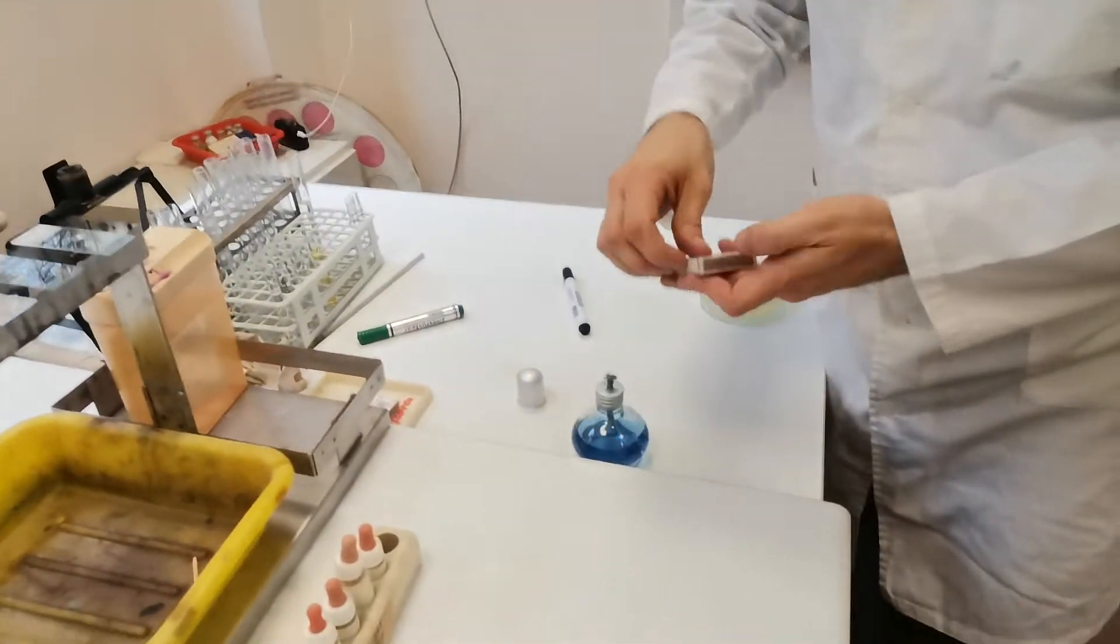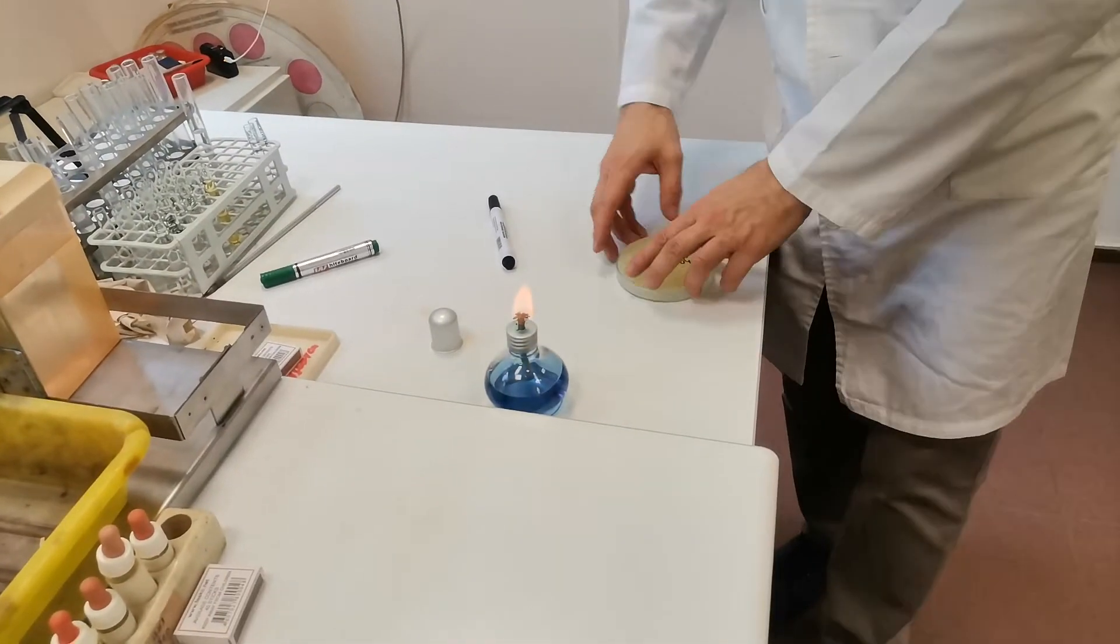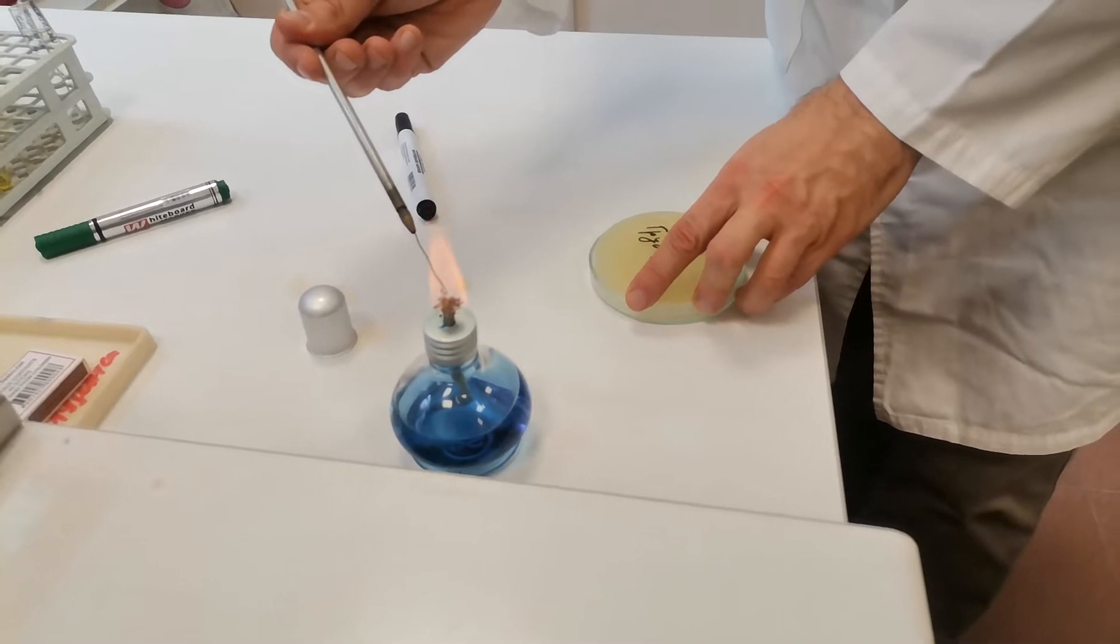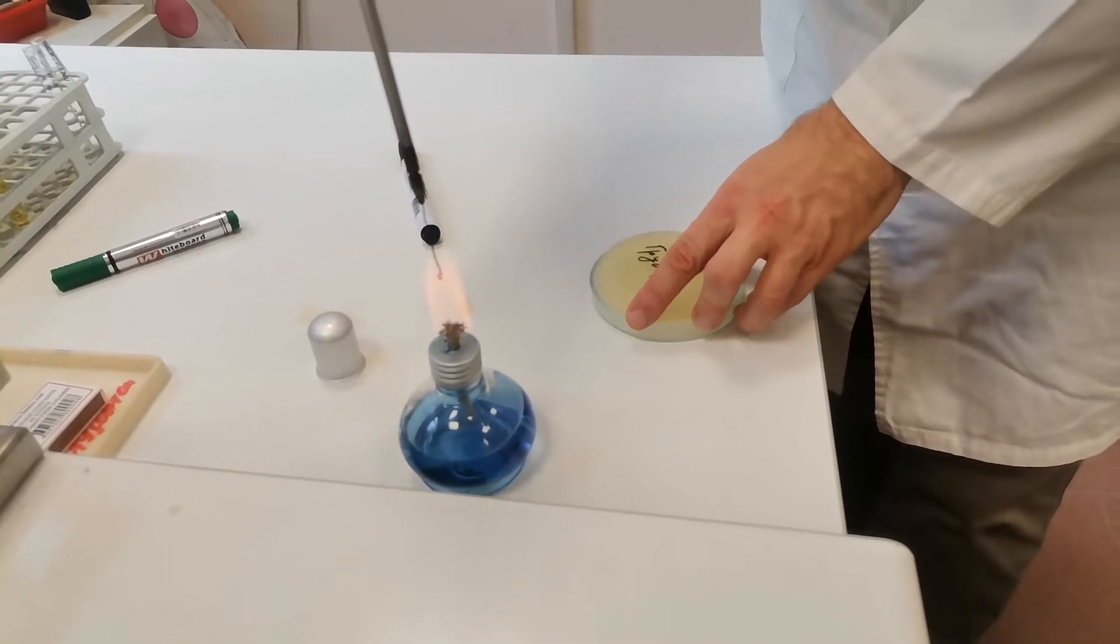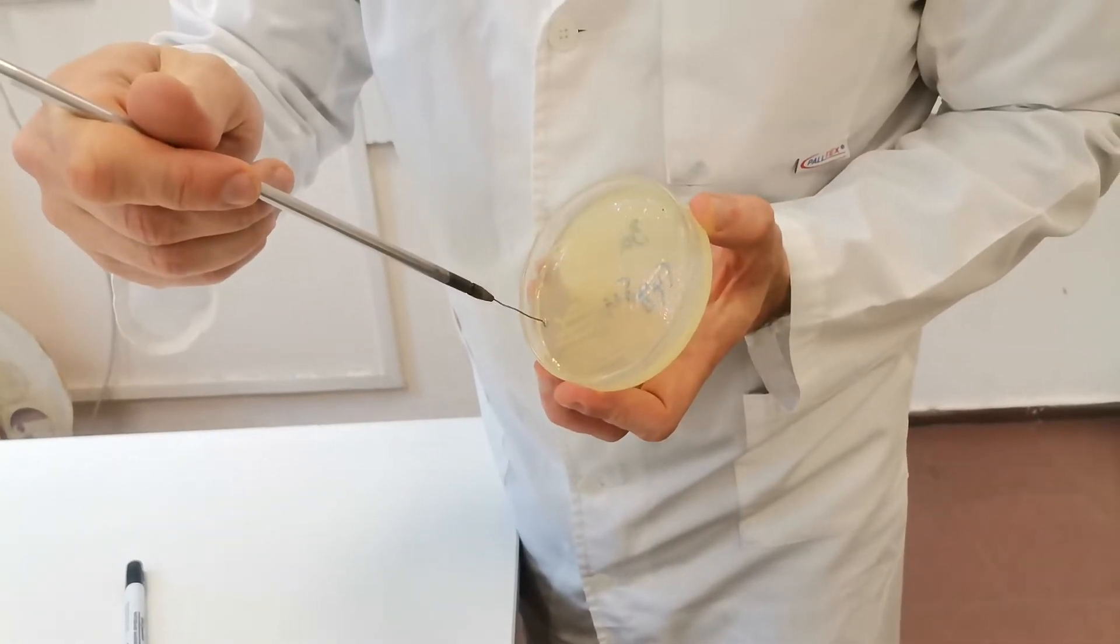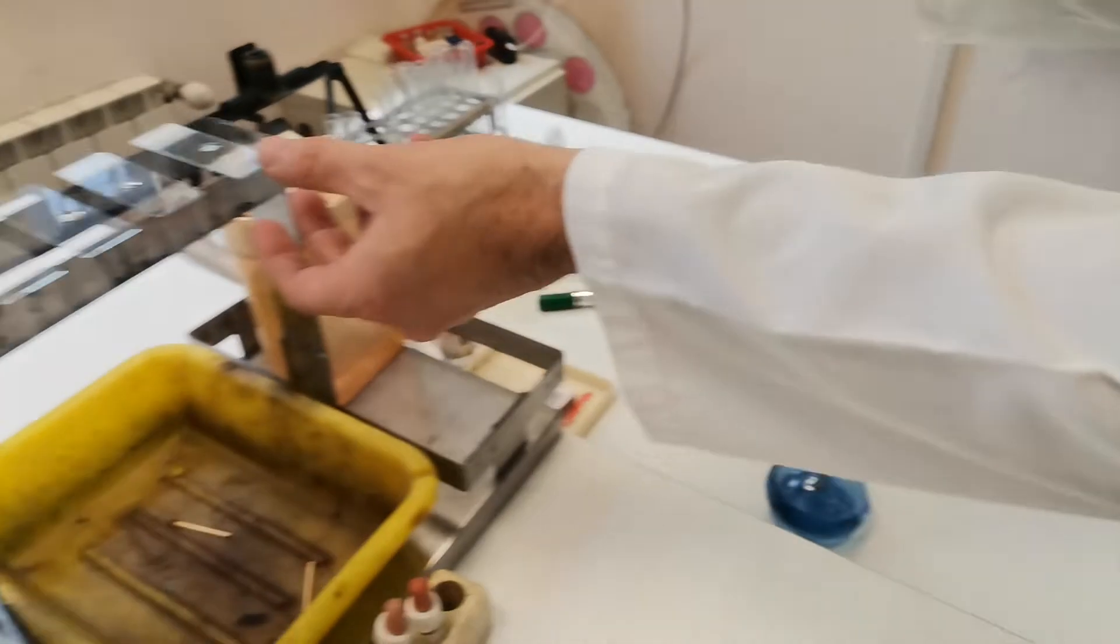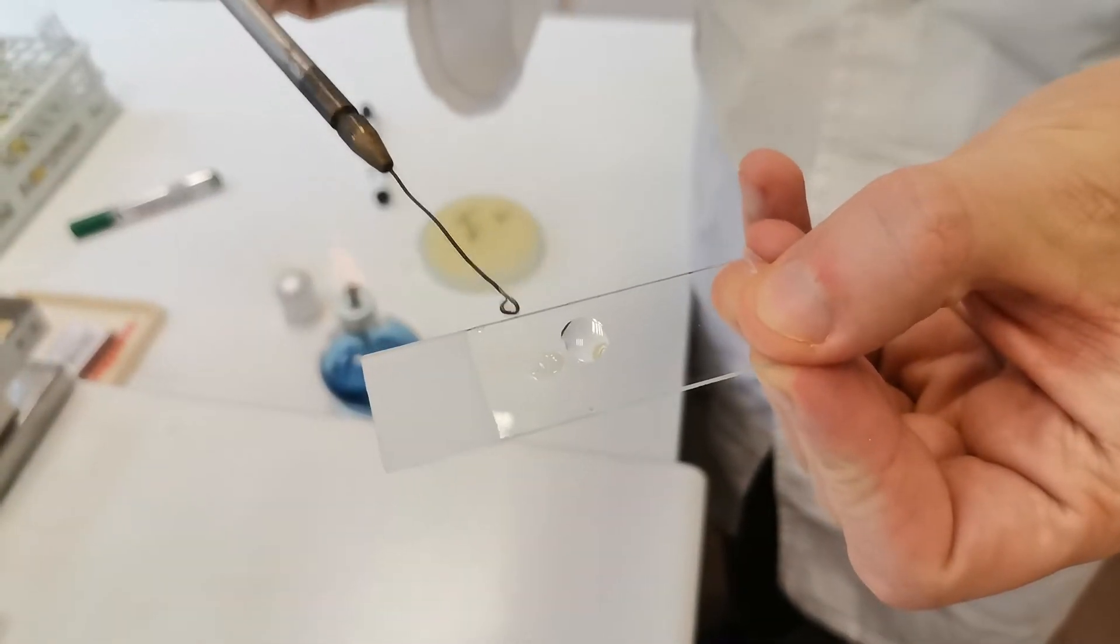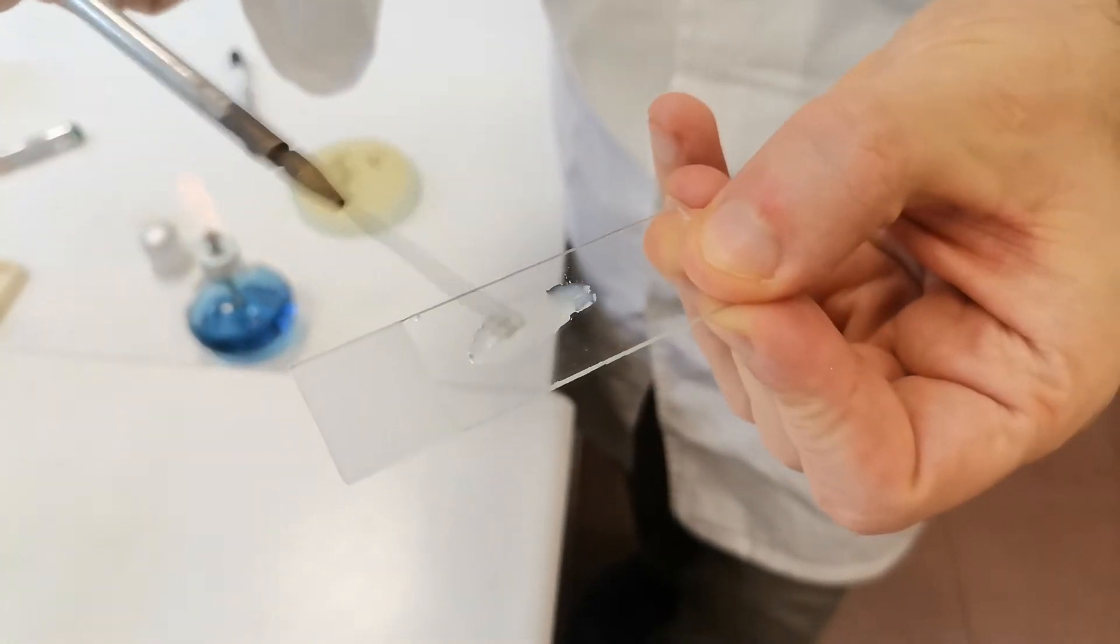Next, I need to start the burner. Sterilize the loop by holding it first in the lower part of the flame where it is cooler and then holding it vertically in the upper, hotter part of the flame until the wire turns red. Then, it must be cooled down by pressing into the agar. Then we will take some of the pure culture. First, I will start with the negative control with the saline. Spread the bacteria near to the drop and then start mixing.